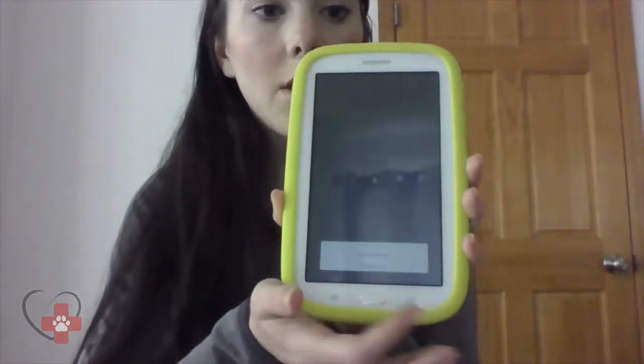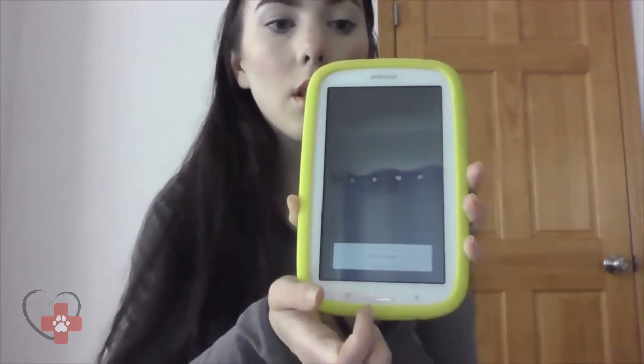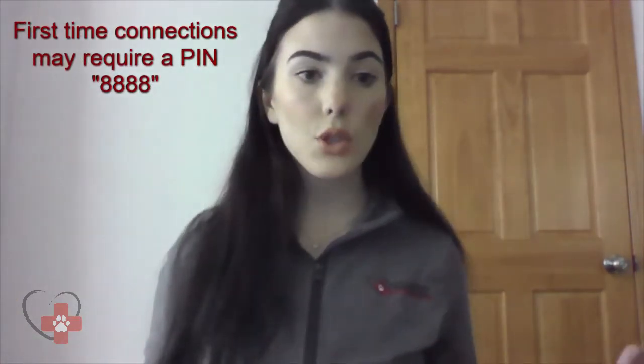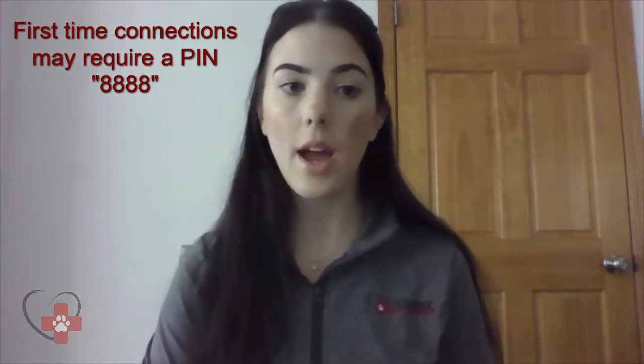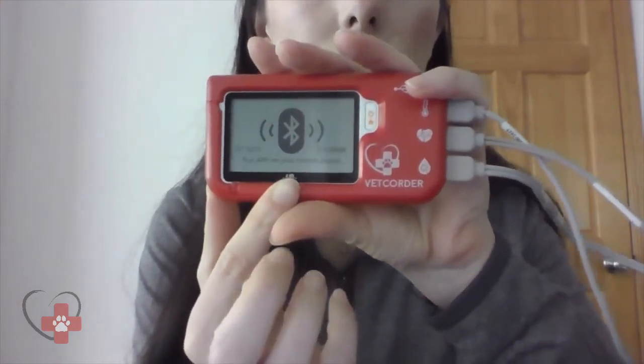We're going to get the option to either view offline data or select our Vet Quarter, and we are going to go ahead and select our Vet Quarter. You may notice when it is your first time connecting your Vet Quarter to a new mobile device, you may be prompted to enter a passcode. Please note that passcode is always going to be 8888. If you ever forget the passcode, feel free to reach out to me, or the screen on your Vet Quarter will display that PIN. You may be prompted to enter this PIN with every new mobile device, whether using the Monitor Vitals app or the Vet Quarter Connect app.